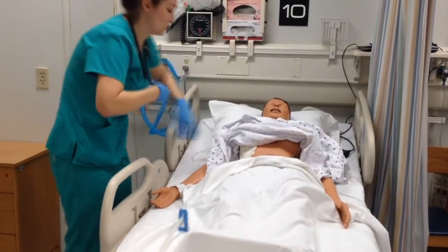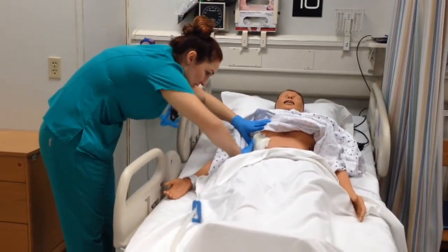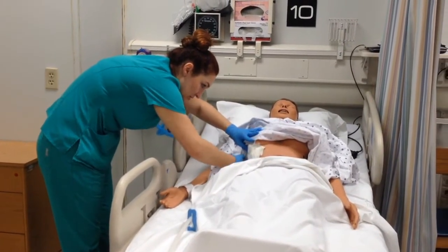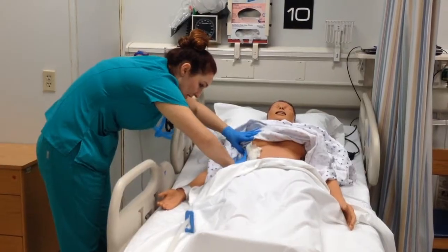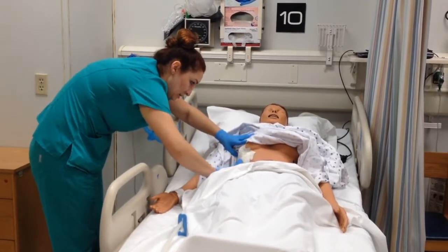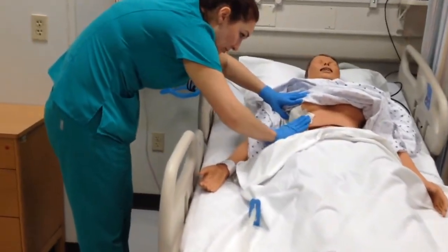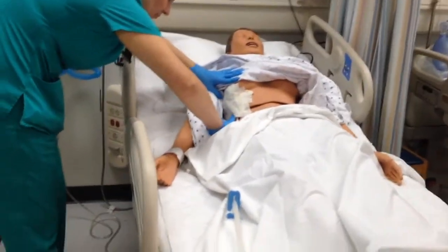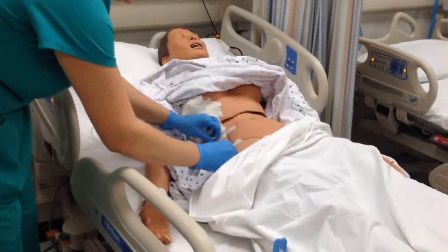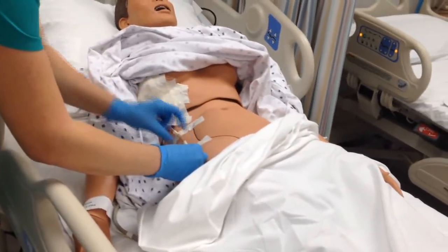I'm going to check the site. Make sure that the tape is intact, the dressing is intact, the skin is dry. There's no subcutaneous emphysema — no crackling sounds or crunchiness when I palpate. There's no drainage, mild tenderness upon palpation. The tube is taped and secured to the body in two separate places.